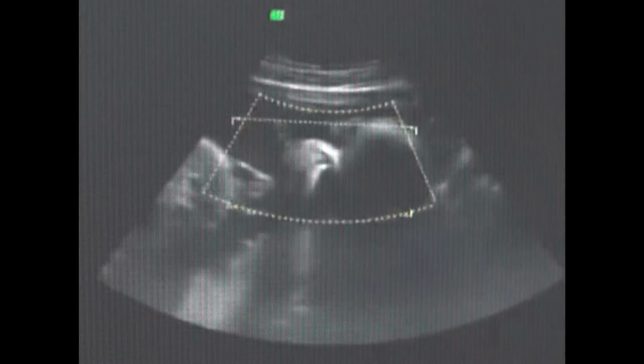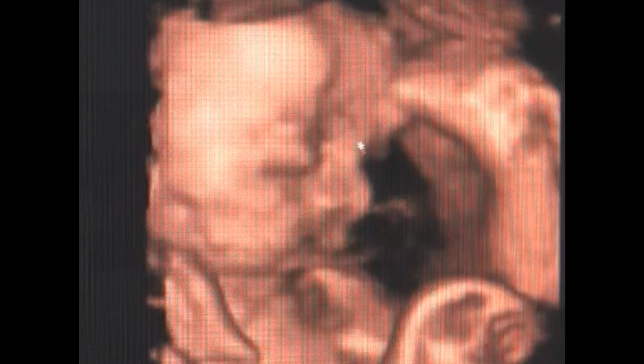I may even get you to walk around and see if that might move her umbilical cord. I don't want her to move. That's the only thing with getting you up to walk. Sometimes they'll move in a direction I don't want them to, but the umbilical cord's there, so I want that to move. Where is that? Oh, that's her foot and little nose. That's her foot. This is the knee of the other. So she's got her foot all the way up to her head.